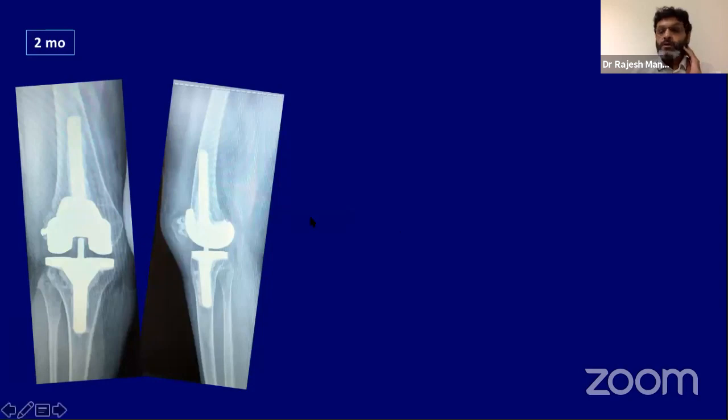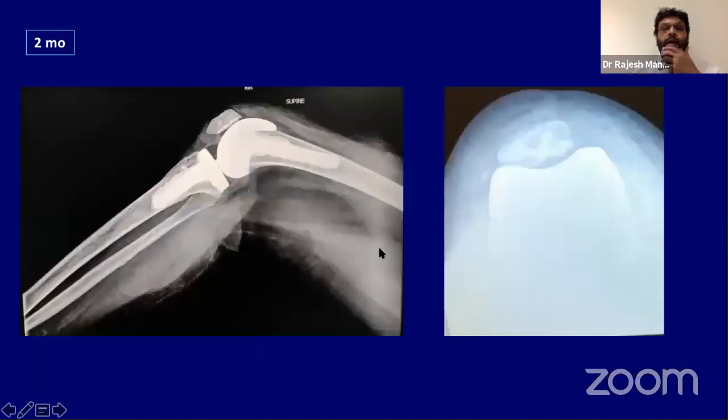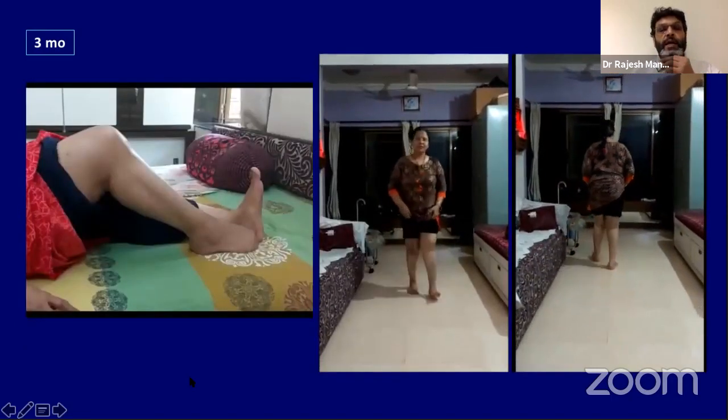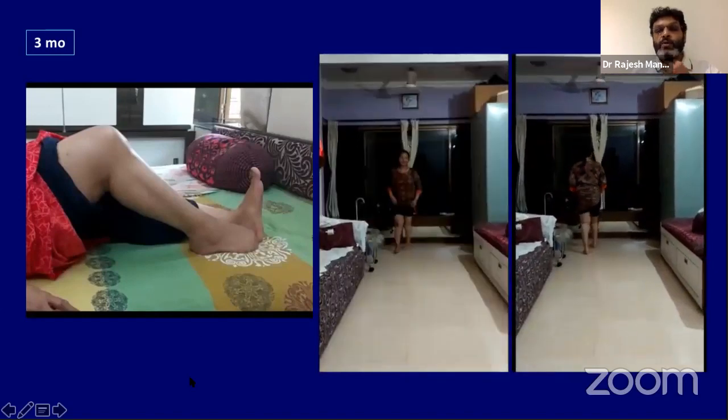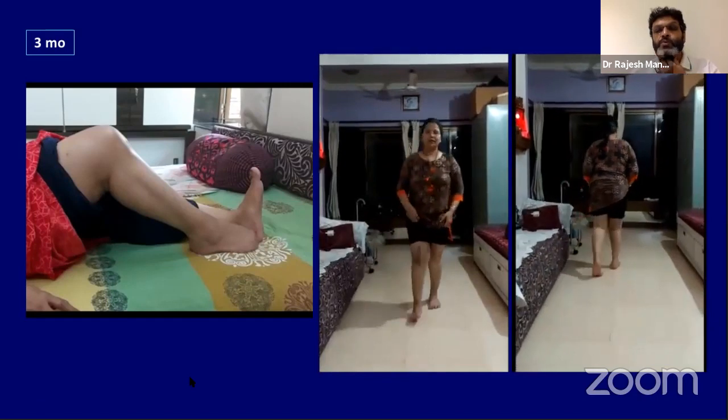This is at 2 months. You can see that the osteotomy distal shift of about 6-7 millimeters. And this is at 2 months, patella sitting right in the front, right in the trochlea. And here is at 3 months, patient bending at this stage about 90 degrees, and I expect it to go a little bit more. But pre-op range was about 115 degrees, which is what I think I should get.